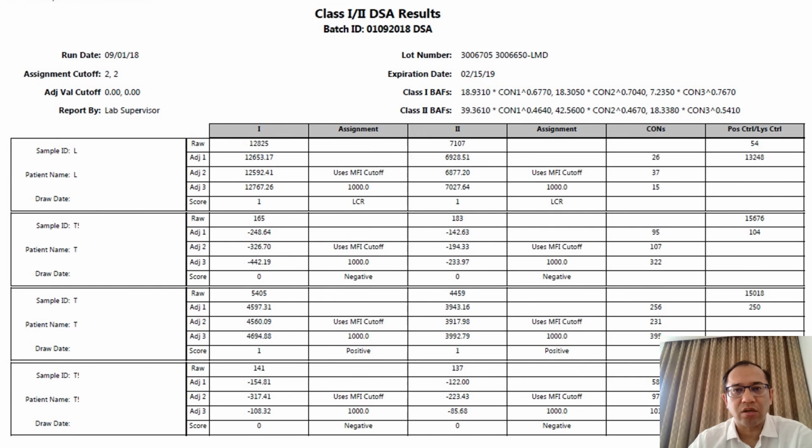Coming to Luminex crossmatch, this is another modality that we perform. It is a Luminex based lysate crossmatch, in which you have to generate a lysate from the donor cells. And how do you do that? You add a detergent to the donor cells, and that is how the HLA inside the nucleus will come out. The HLA is then bound to the capture antibodies.